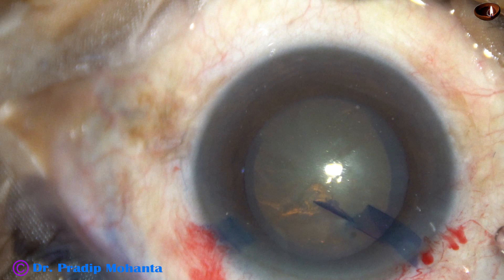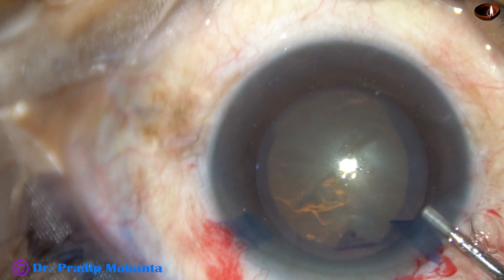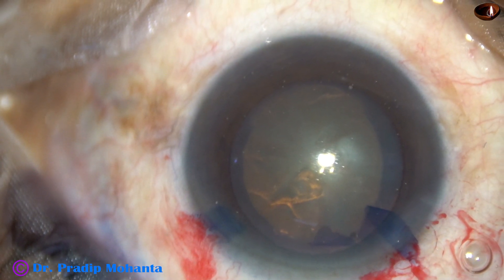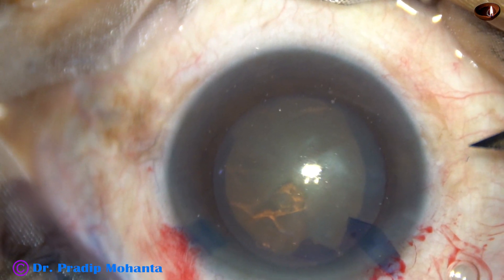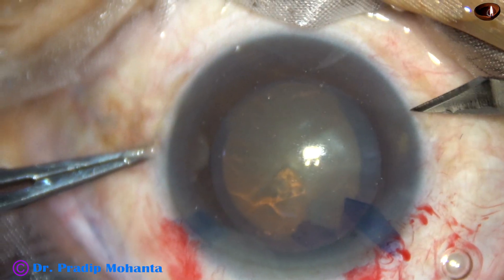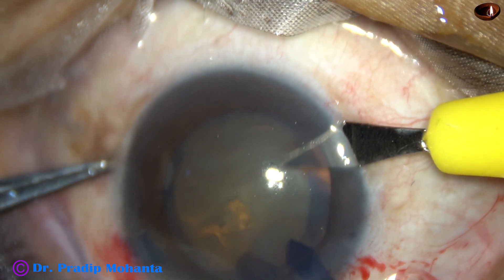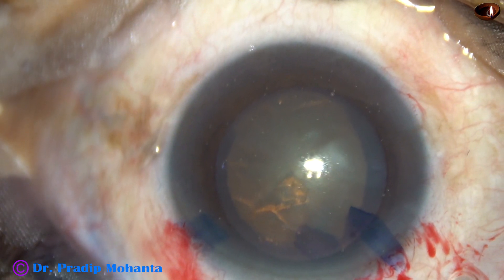This is a very soft cataract. In this video, I want to show the lens tilt technique. By this time, the main incision has been made. One side port has been made on the left side of the main incision. Capsulorhexis has been done. And now I am going to make one more side port on the right side of the main incision. The side ports are about 3 clock hours away from the main incision.